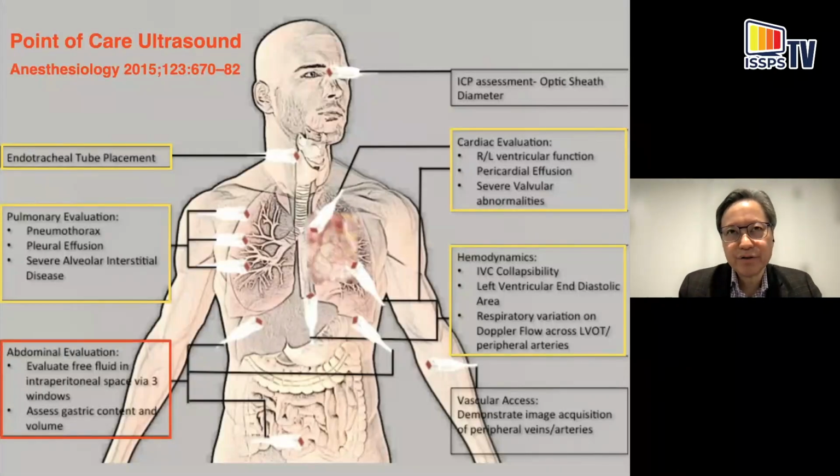I think as you have heard repeatedly in this webinar, the key to success for any point of care ultrasound application is keep practicing, keep scanning until you acquire the hands-on experience to capture a good image. The more you scan, the more comfortable and confident you become. So for me, I often practice POCUS examination after doing a nerve block procedure as a practice.